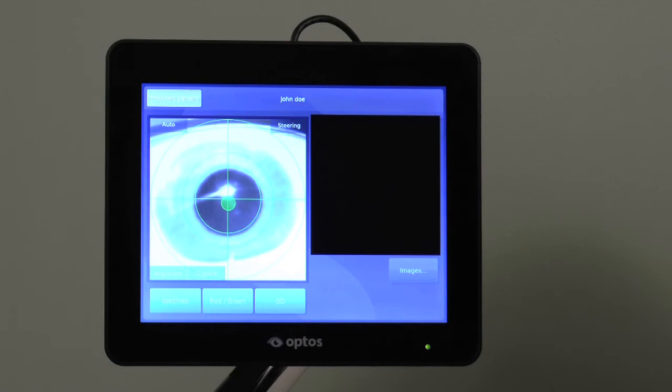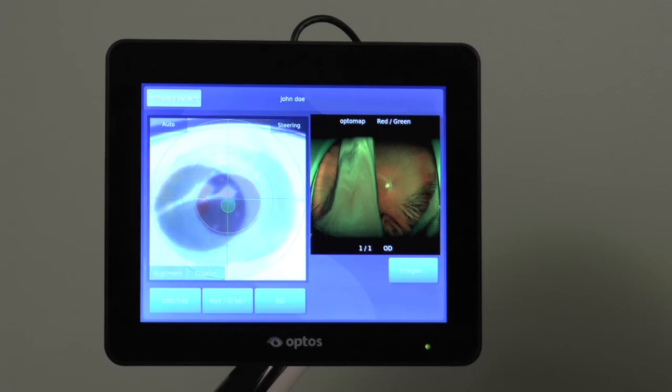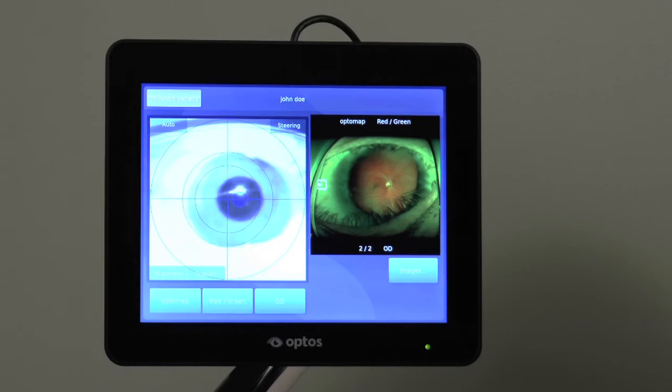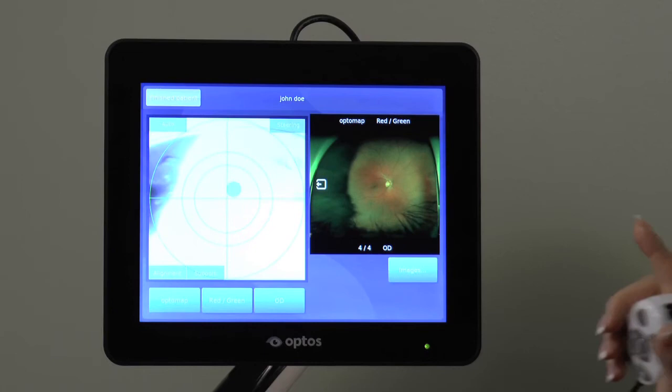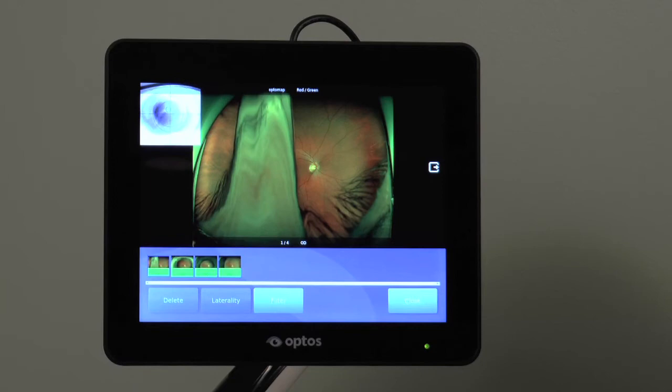Less than optimal or unusable images may be captured if the patient blinks, is in too close, too far back, or if the crosshairs are not well centered on the pupil. Due to the fact that images are captured during a 3-tenths of a second scan, blinks tend to look like this.